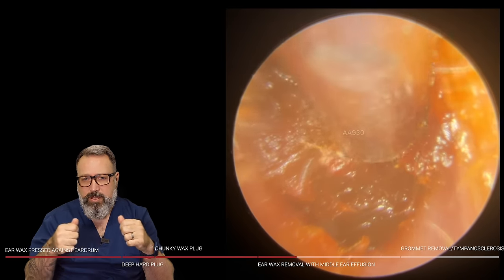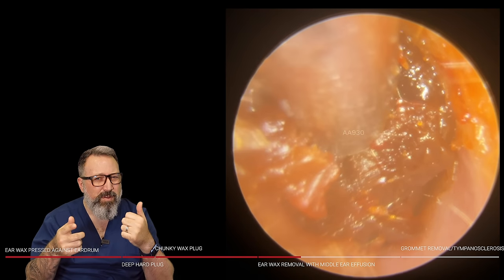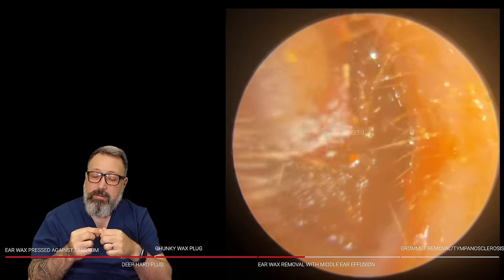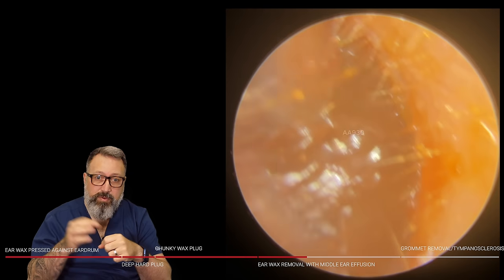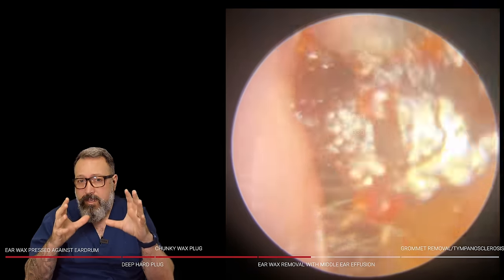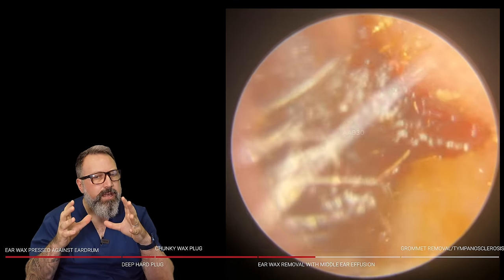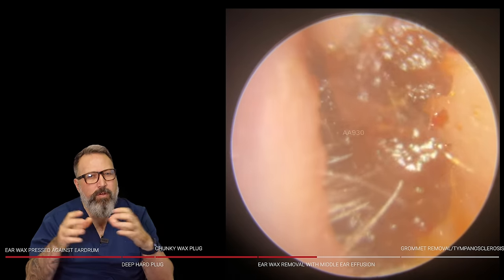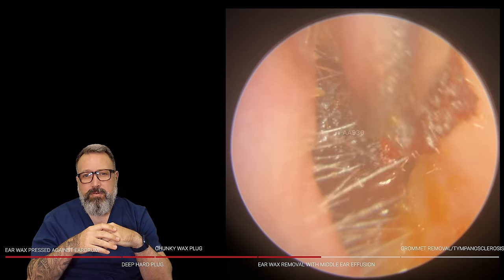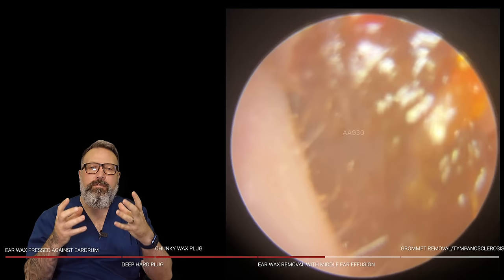Some audiologists suggest putting a little bit of olive oil in the tube, but I find it's not particularly effective with very mushy types of wax — it just sticks quickly on the inside of the tube. All the tubes do come with little pipe cleaners so you can push through and unblock them. We've now got a grip on the harder nugget of wax at the core of this plug at the entrance to the canal. It's a little too big to fit out, so we give it a wiggle and break it down just inside the entrance — there we go, it's on its way.